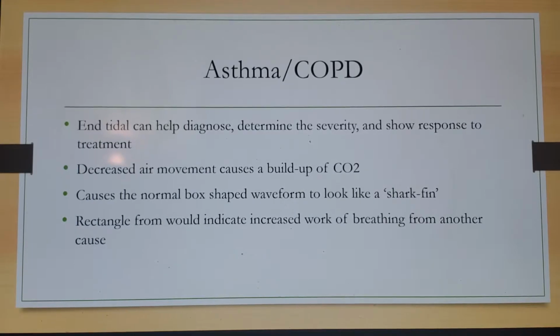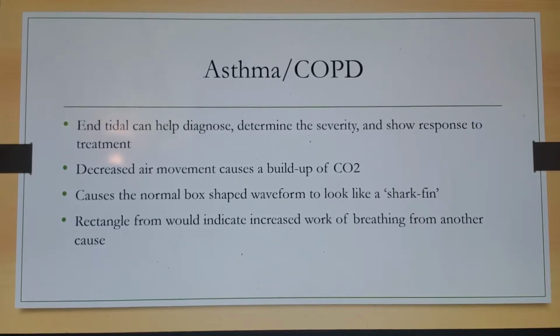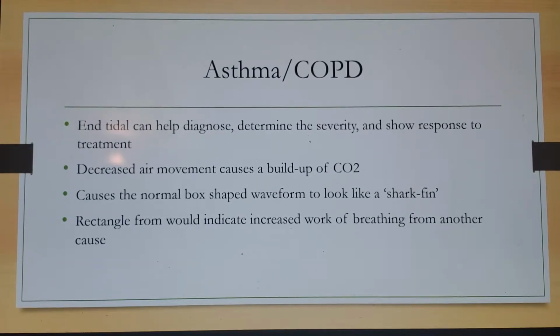One of the first things we like to talk about is asthma and COPD. End-tidal can help diagnose, determine the severity, and show the response to treatment for these patients. Decreased air movement causes a buildup of CO2, and it causes the normal box-shaped waveform to look more like a shark fin, and I'll show you a picture of that.